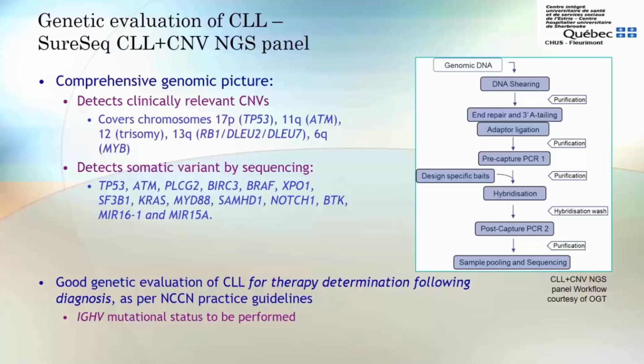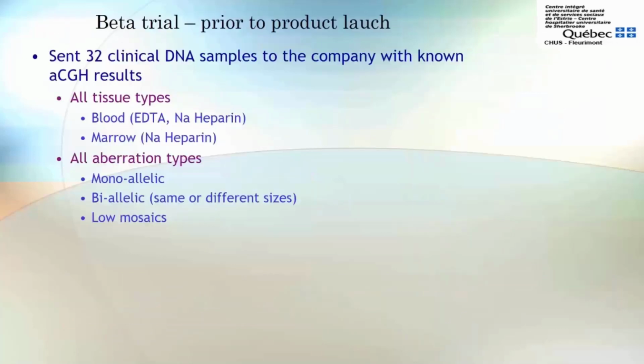However, would an NGS assay based on capture really be able to detect accurately large CNVs as observed in CLL? We were really not sure. And then we were offered to participate in a product development trial, and we said, sure, yes, we're interested.